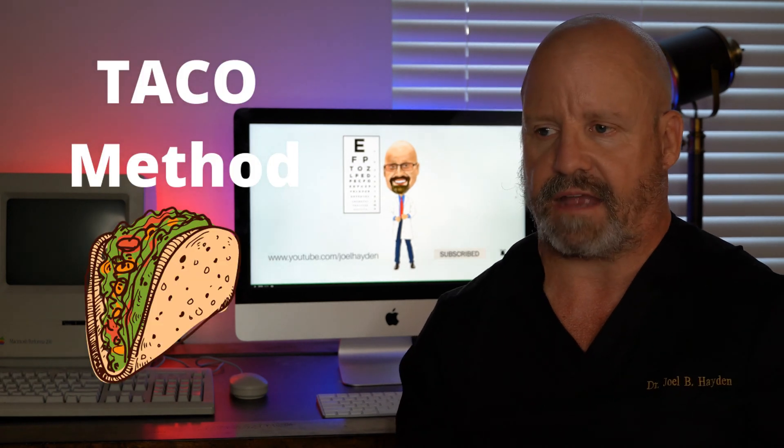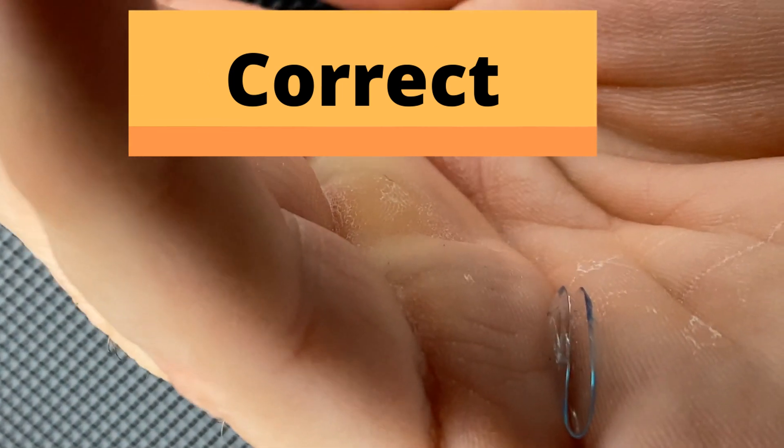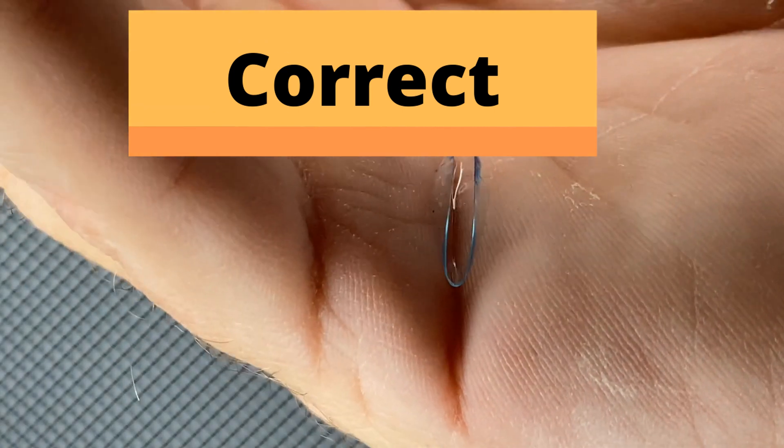That's the first way to tell. The second way is something called the taco method. The taco method refers to the lens coming up as you squeeze it. If you have it sitting on the edge of your finger and squeeze it, it will look like it wants to close in on itself. Versus if it's inside out, it will veer out at the top. A lot of people like to put it into the prominent crease of their hand and squeeze — it's a very good way of telling if it's inside out or not.